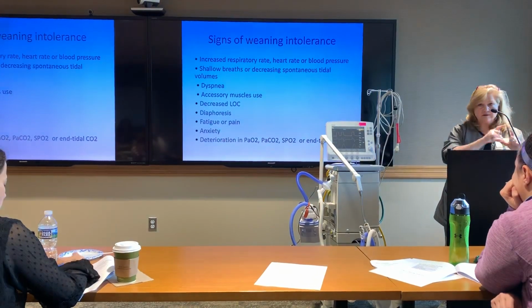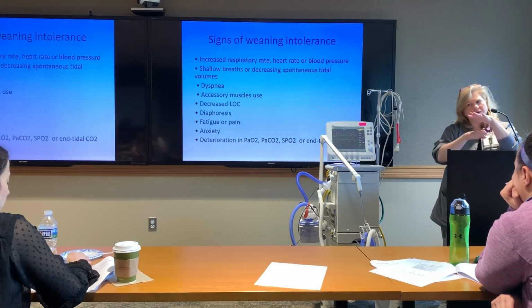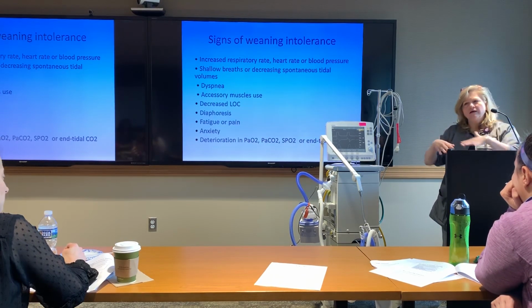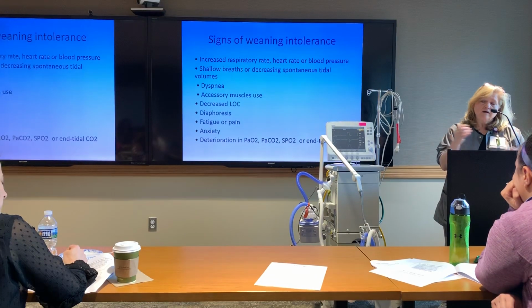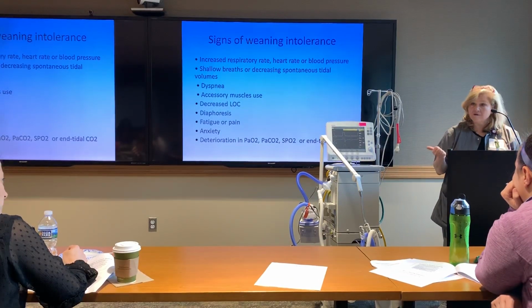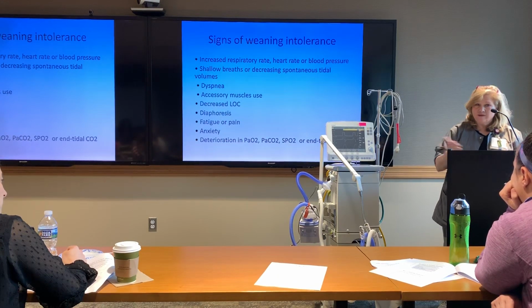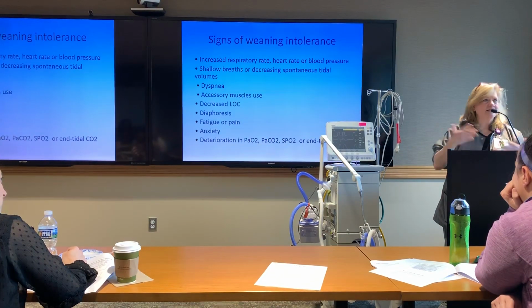So if you're looking at how the patient's doing during his SBT and you start to see his respiratory rate starting to climb maybe a little bit and tidal volumes maybe dropping a little, you might want to look at that number to see how much it changed over the course of the 2-hour trial. A 30-minute trial is sometimes all you need. 30 minutes to 120 minutes is really all you need for a spontaneous breathing trial. We just do a standard 2 hours here because that's just the way the protocol was written, but it does not have to last that long.